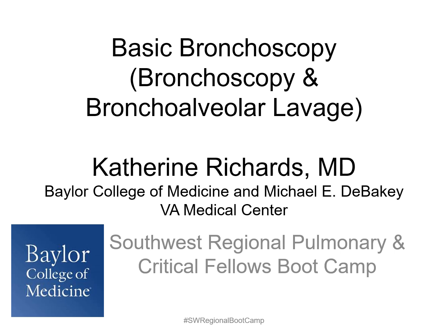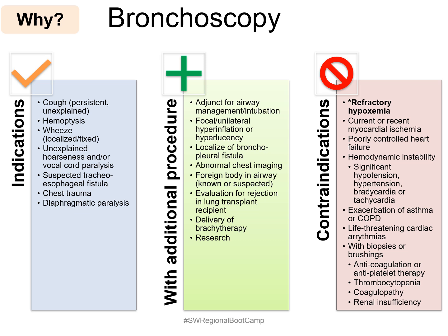I'm Katie Richards, and I will be reviewing our first topic on basic bronchoscopy, covering bronchoscopy as a whole and bronchoalveolar lavage. There are a wide variety of indications for bronchoscopy. Airway inspection may be beneficial in the workup of persistent unexplained cough, hemoptysis, localized wheezing, hoarseness, suspected vocal cord paralysis or tracheoesophageal fistulas, and chest trauma or diaphragmatic paralysis.